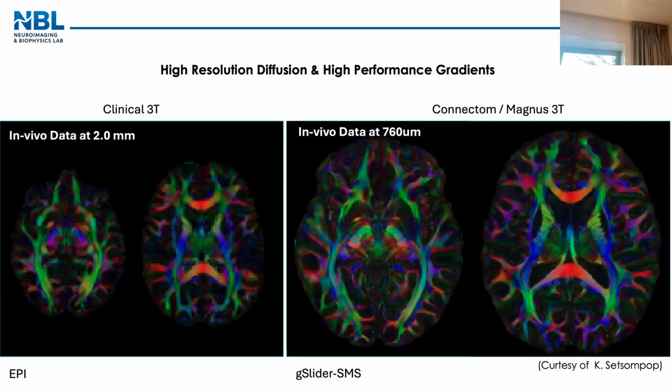Now you can clearly see where it's located, for example whether the tumor is between two tracts or not, or if you can even see infiltration in better detail. So that is the goal we're hoping to get.